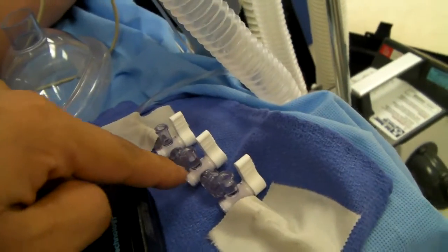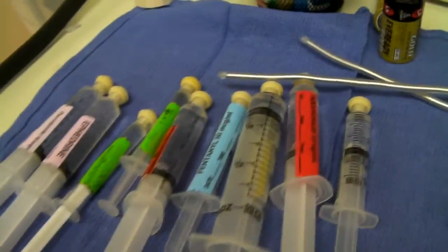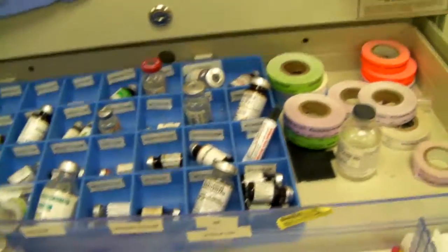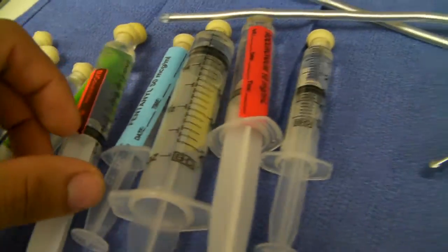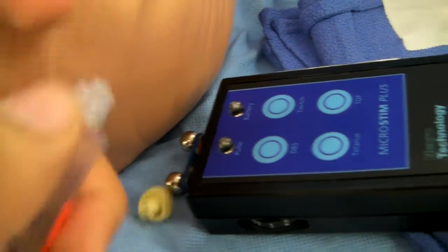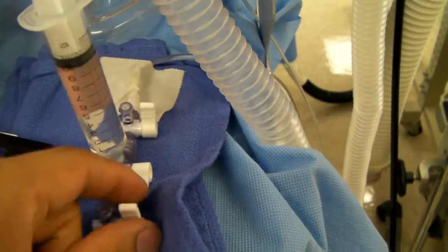This is how you push the fluids into the IV line, which is connected to the patient. For example, these are all the drugs that I had to draw up from the cabinet of drugs. So you would take something like succinylcholine, which is a muscle relaxant, and undo this top, put it here, and then open this.